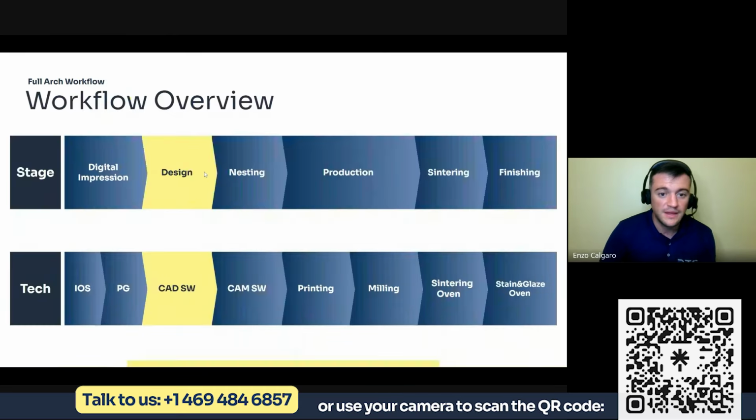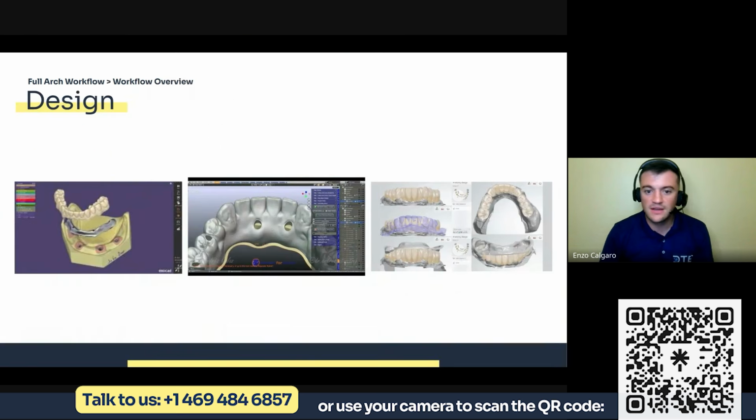Now, let's talk a little bit about design. I know many of you want to learn how to design, and if we were here to teach you how to design, we could probably spend 4 days just talking about that. So what I'm going to talk about are the real basics of a design software, okay? So here we have 3 options, probably the 3 most common options.